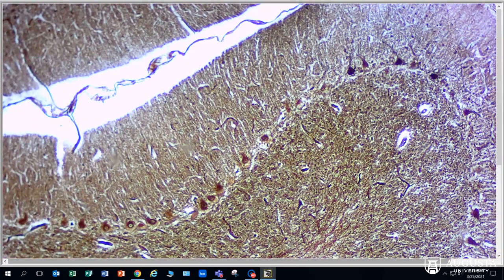Keep the terminology here very clear. Cerebellum contains Purkinje cells. You'll need to compare this with the tissue histology for the cerebrum, which contains pyramidal cells. Students often confuse the two. So when you see these darkly staining cells in a line, those are the Purkinje cells of the cerebellum.